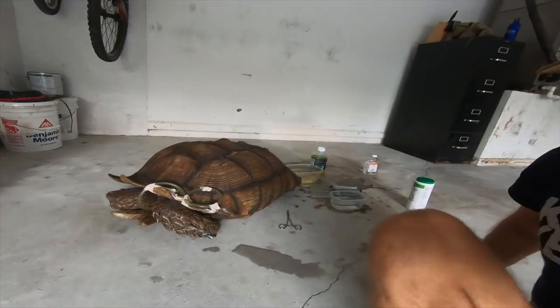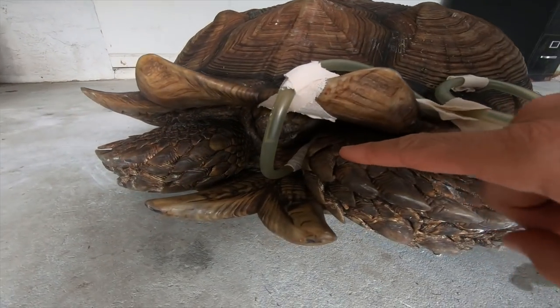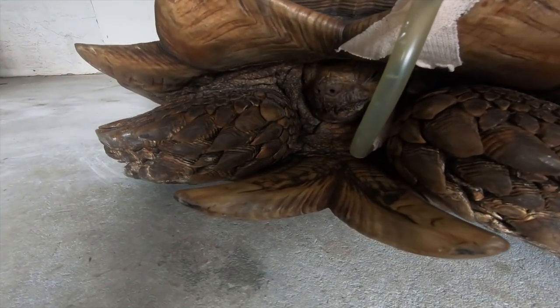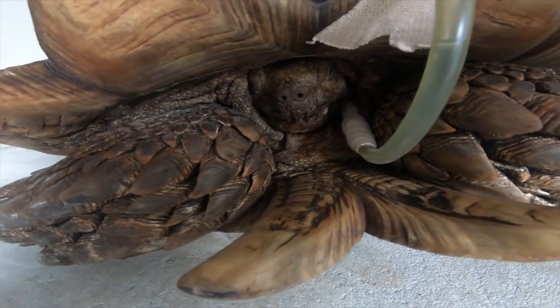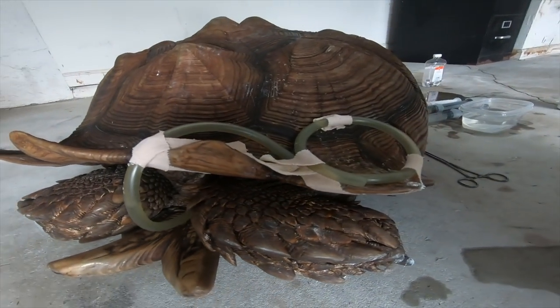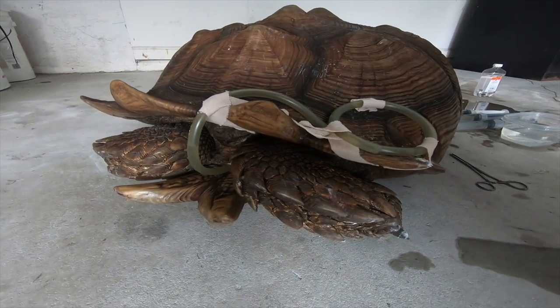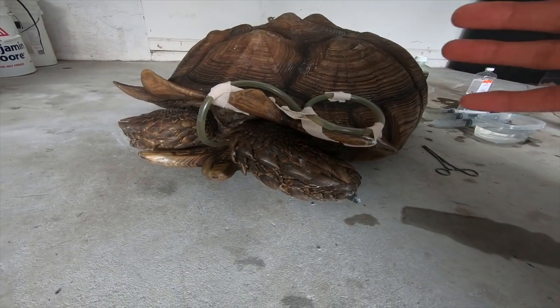What's going on, everyone? Kenan here, and so many of you have been asking about Lumpy and how he's doing, and what have I been doing to keep his health up? And obviously, guys, we've got this feeding tube that goes into his neck right there. It had to be surgically placed into his neck, and it goes right down into a smaller tube into his stomach. Now, this is a very aggressive way of trying to get this animal to turn around as far as health is considering, because it's a surgical solution.